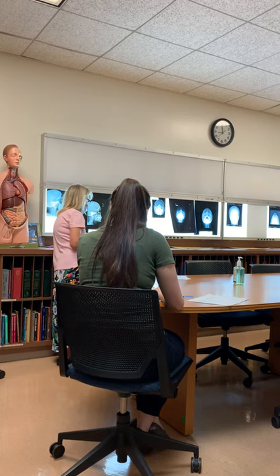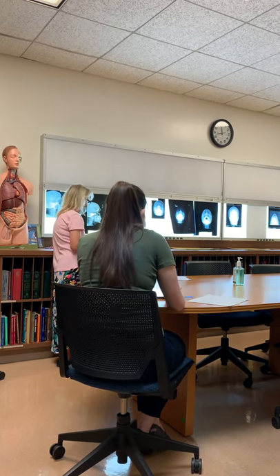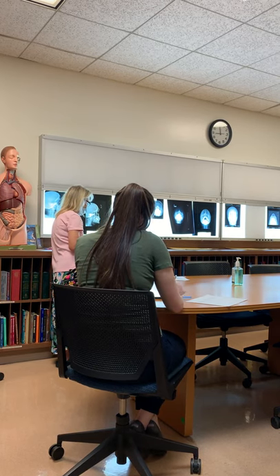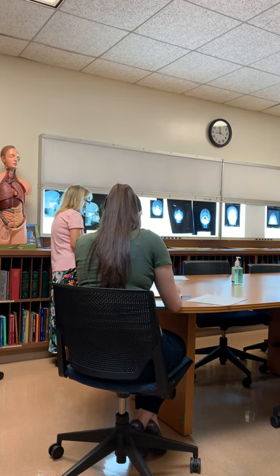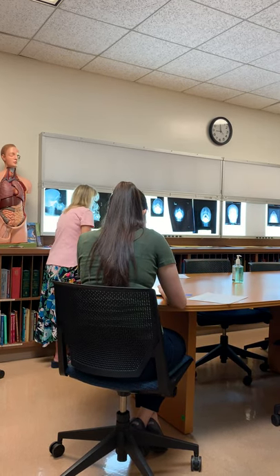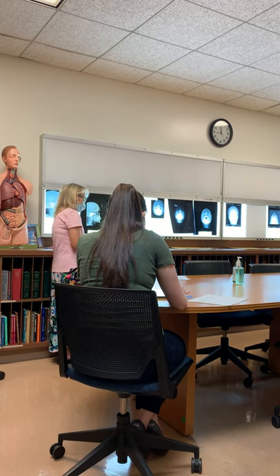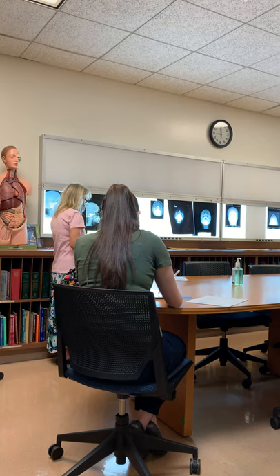Okay. For some reason, the registry likes this next statement. The base forms a 37 degree angle with the median sagittal plane. Don't ask me why that's significant, I don't know. Okay, now the apex is the narrow posterior point. That's where the optic foramen is. And it, another one of these registry things, forms a 30 degree angle with the OML.